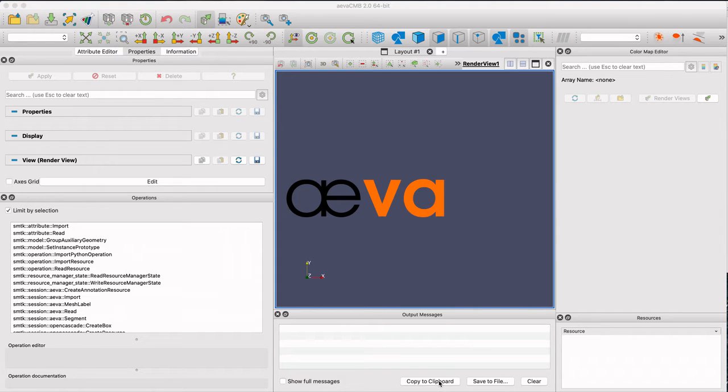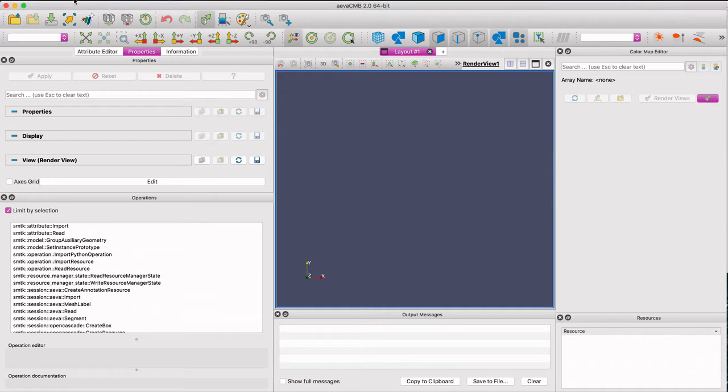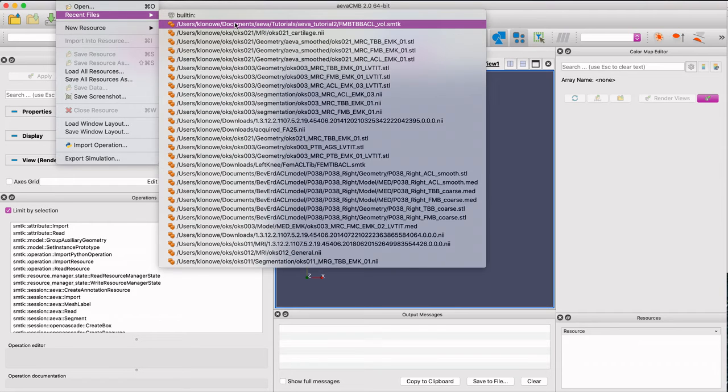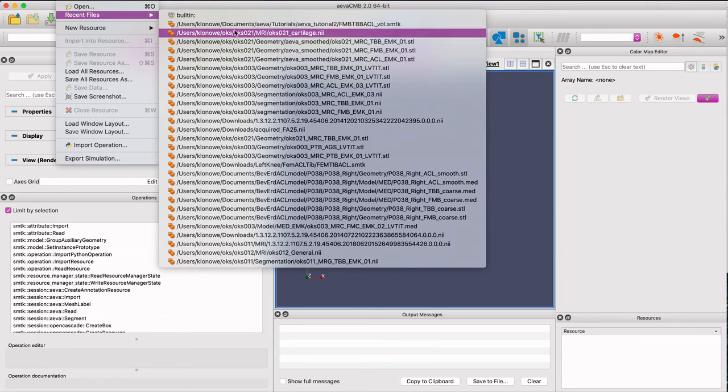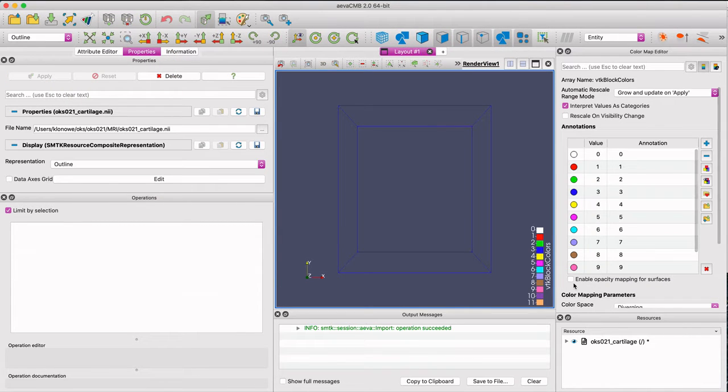This video is intended to highlight AVA CMB's volume inspect feature. I'll demonstrate how to use three surfaces - a femur, tibia, and ACL - along with the MRI volume it was segmented from to show how the volume inspect tool can be used.